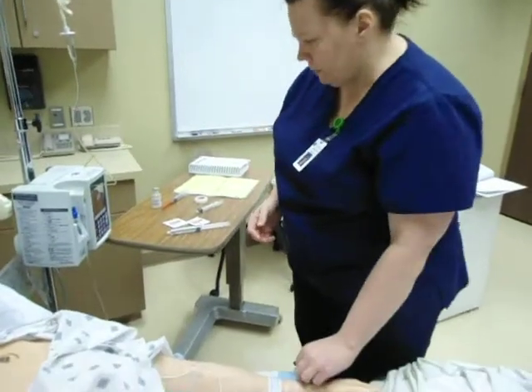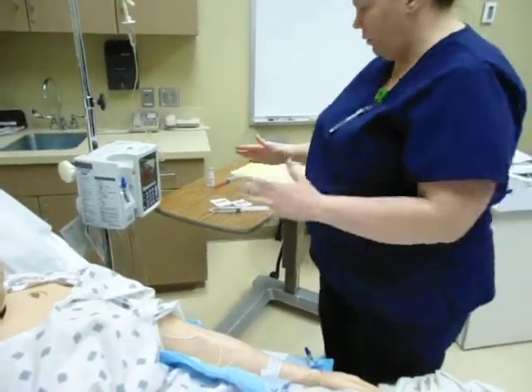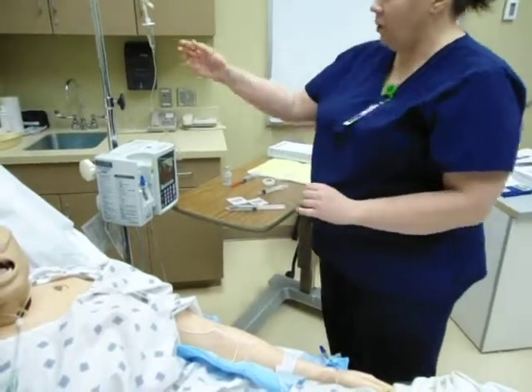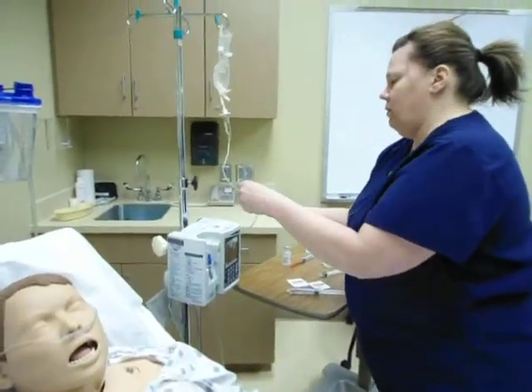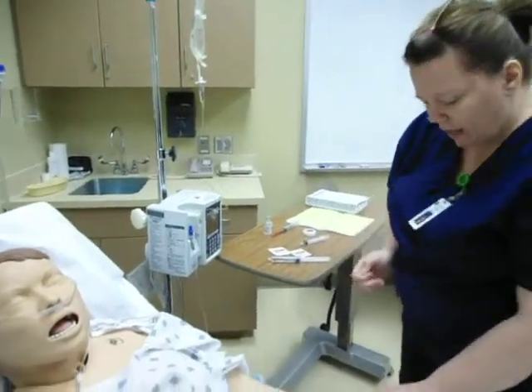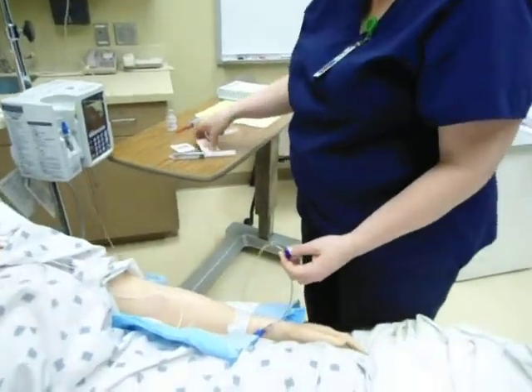So then I'm going to go ahead, and I know that this drug is not compatible. When I did my 5 rights, I know it's not compatible with this. So I'm going to go ahead and stop the infusion. I'm going to go ahead and clamp so it's not running, and I've found the port closest to the patient. I'm going to go ahead.